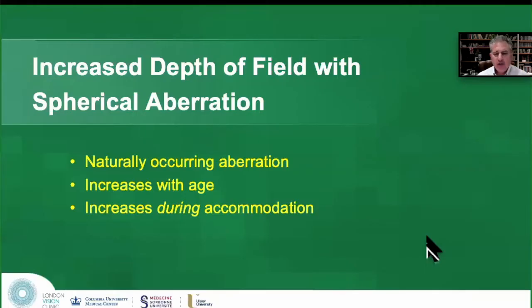So if we now move on to the modality, which I believe is becoming the common standard across all corneal and lens options, and which we started looking at with spherical aberration in the early 2000s and is now this Presbyond product by Zeiss, I discovered that spherical aberration increases depth of field. I'll come to that in a minute.